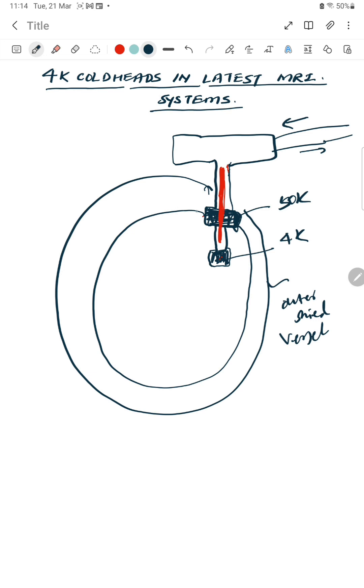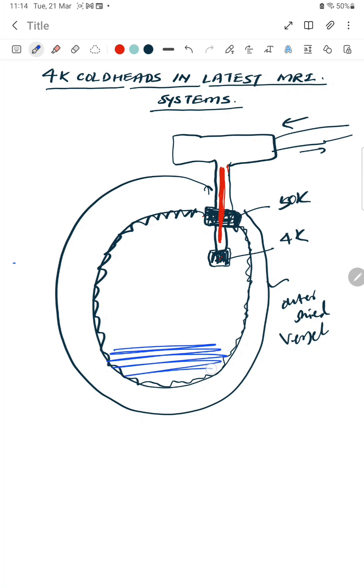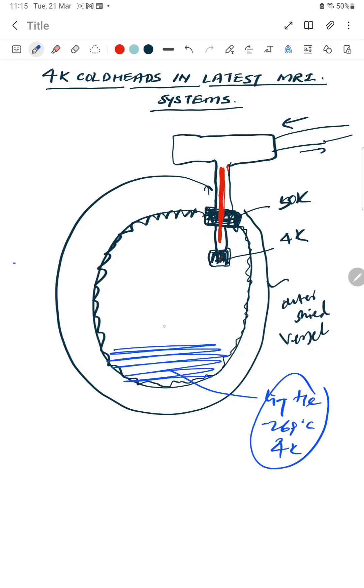There is a shield inside the MRI — the shield captures the cooling effect and prevents it from escaping. Inside there is liquid helium, shown in blue — that is minus 269 degrees centigrade, or 4 Kelvin — along with some gaseous clouds. The first stage is connected with the 50 Kelvin shield, so this is called the 50 Kelvin stage, and the second stage is the 4 Kelvin stage.